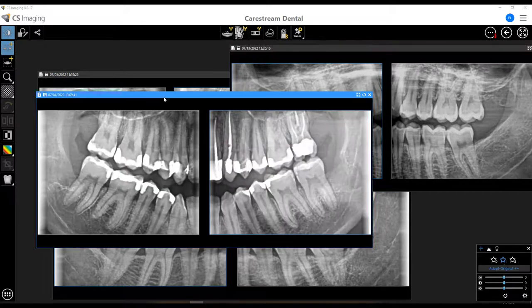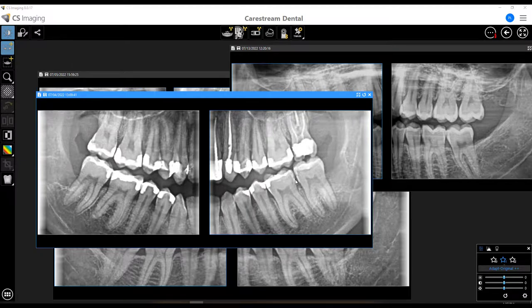Here's an example of a bitewing captured where the patient was not positioned correctly. We can still see decay approximately over here, which is nice, but you can see the chin is way too far down.